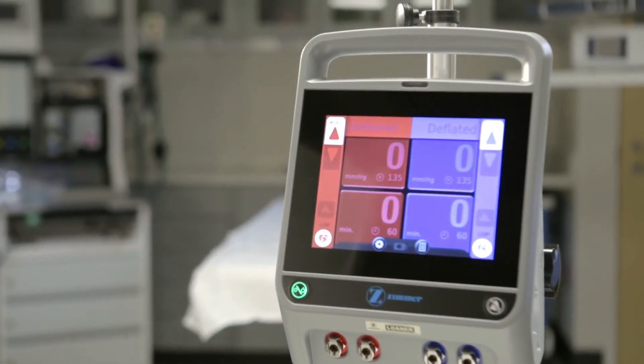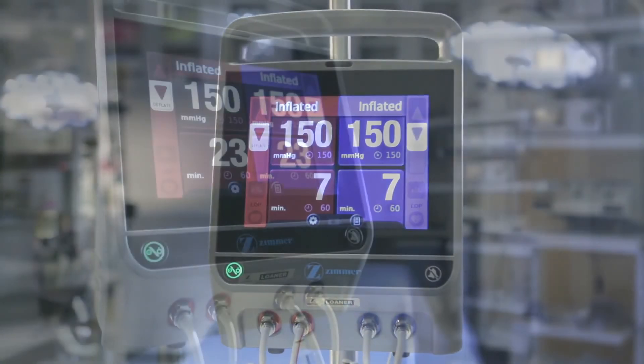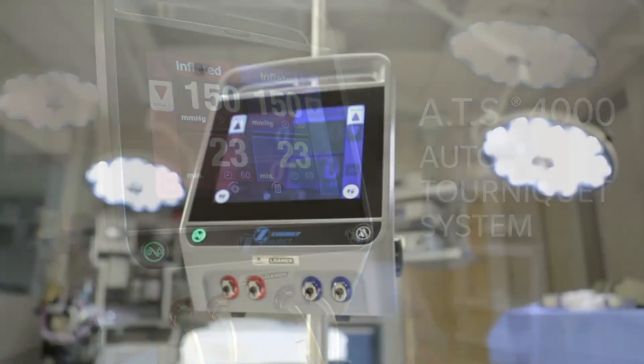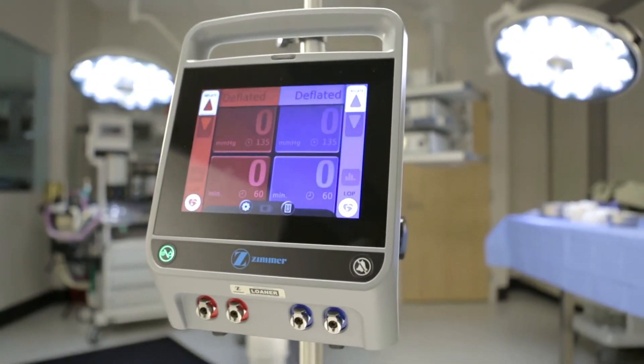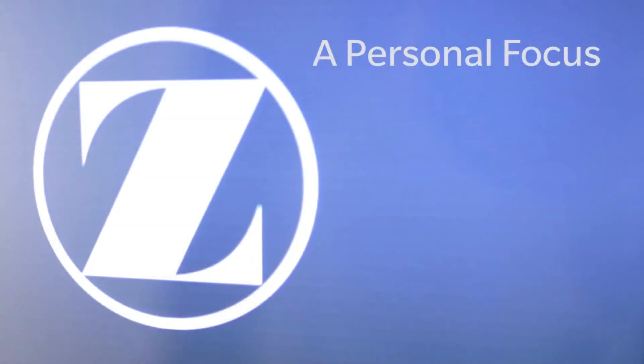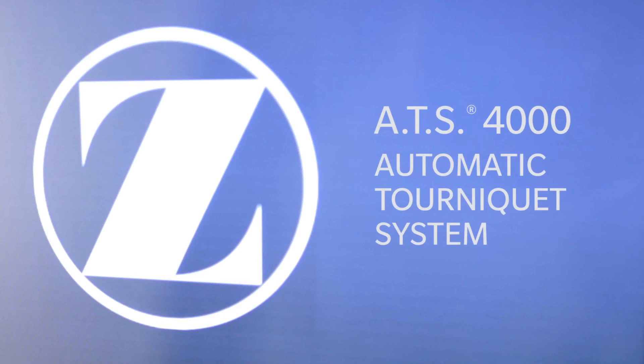With a large and intuitive touch screen interface and powerful personalized pressure technology, the ATS 4000 tourniquet system from Zimmer Biomet is not only a leader in its field, but offers a way to truly differentiate and personalize the patient experience. A personal focus, a personalized fit. ATS 4000 from Zimmer Biomet.